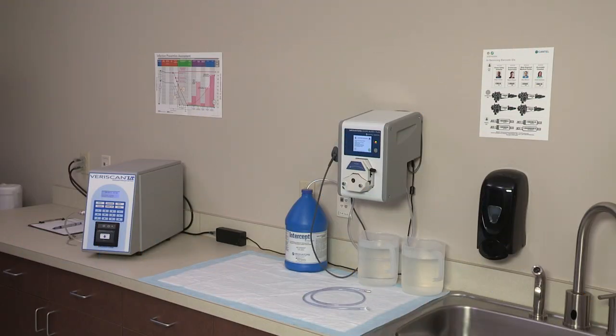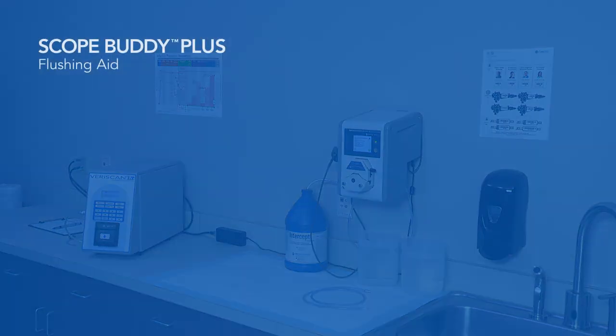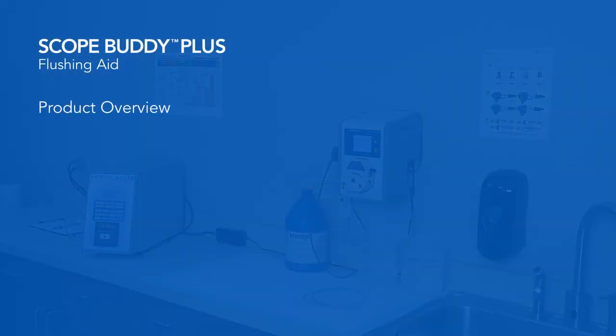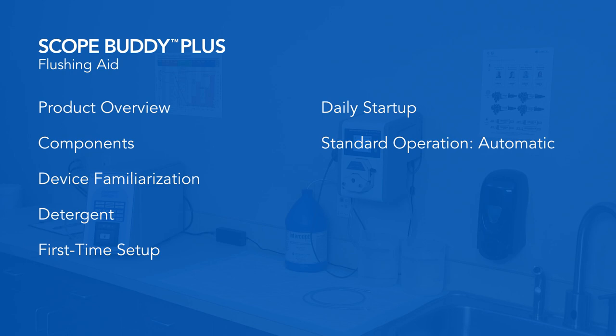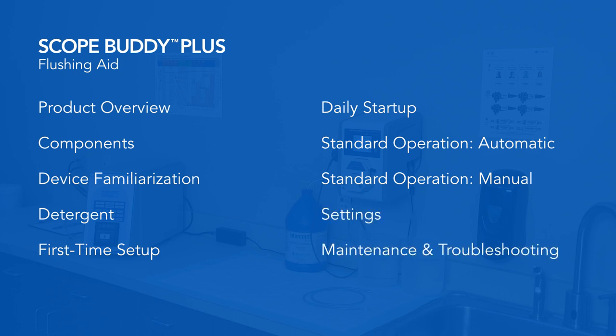This video is divided into segments so you can easily review specific topics as needed. These segments include an introduction to the Scope Buddy Plus Flushing Aid and infection prevention guidelines, an overview of key components, device familiarization, detergent used by the Scope Buddy Plus Flushing Aid, first-time setup, daily startup tasks, standard operation procedures in automatic and manual mode, settings, and maintenance and troubleshooting.